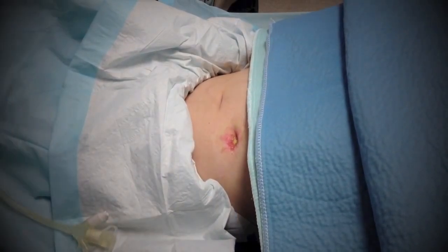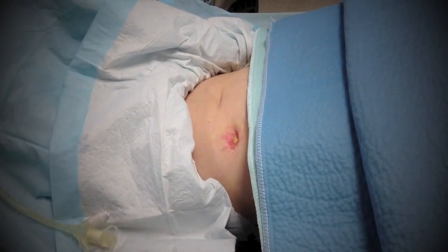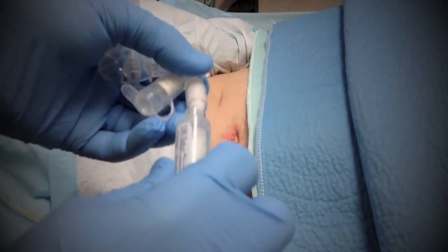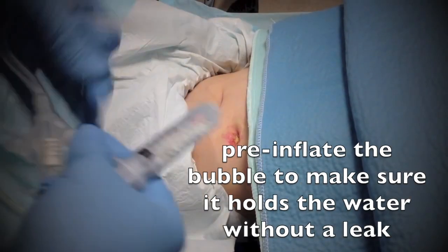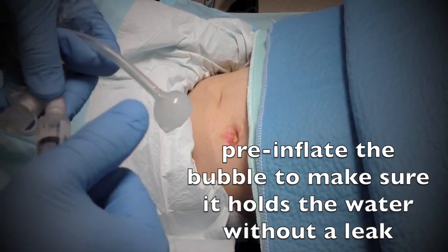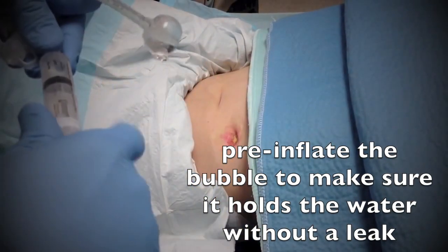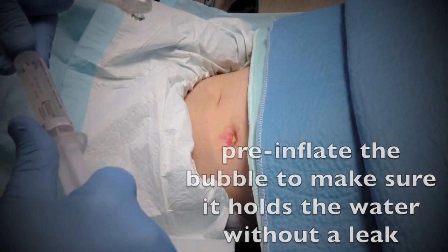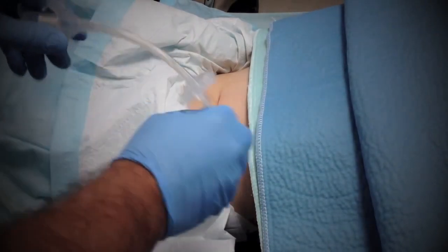inflates. Kind of like a Foley catheter, you always want to test it to make sure there's no leakage before you go in. So you put some saline in and make sure that everything's mechanically correct with the tube. And that's nice and hard. And we take all that saline out. So that's the big water balloon that's going to be in there once we introduce it.